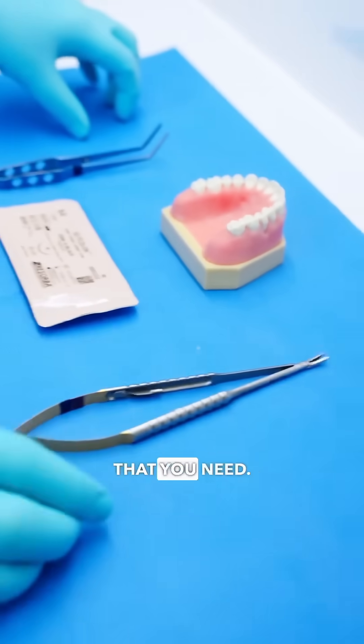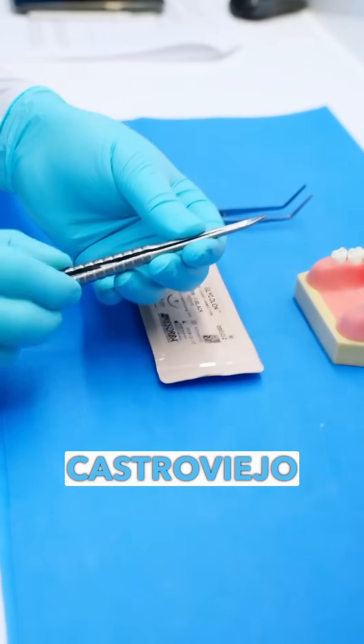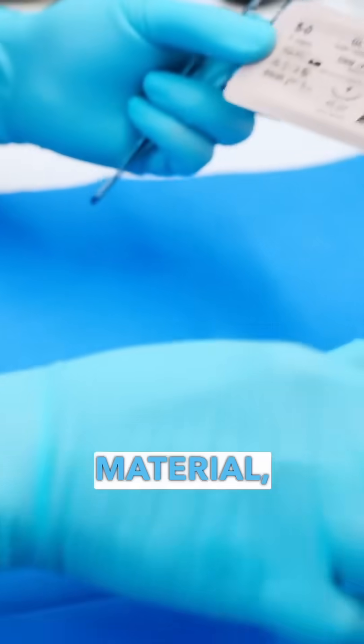And these are the three things that you need: what's called a needle driver — in this case, this is a Castro Viejo needle driver — your tissue pickups, the suture material, and a patient.